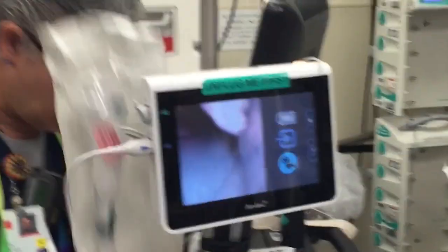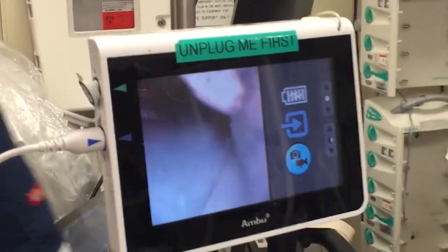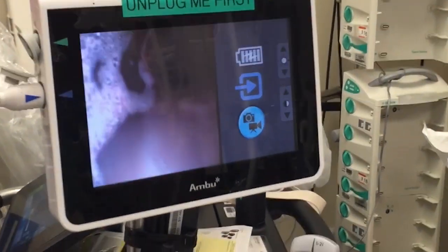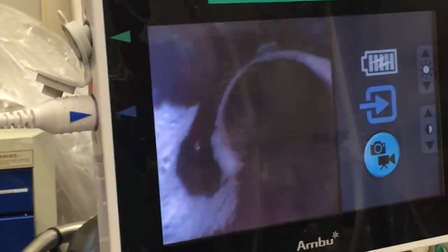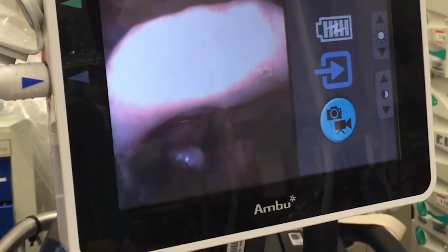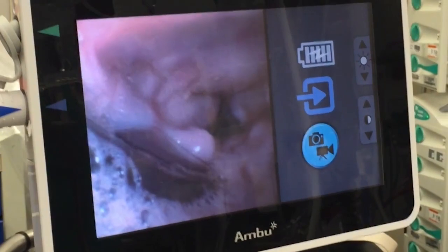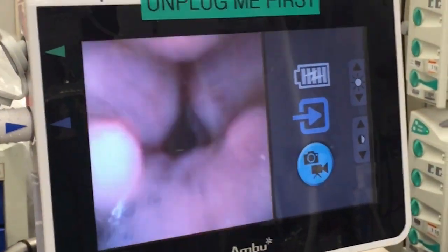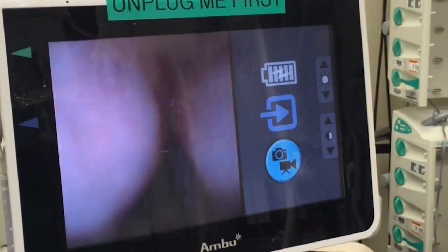Now you're seeing the scope coming out the end of the barrel of the LMA. There you go — you can see the cords right ahead of you. Now take your time. He's paralyzed and being ventilated. Just drive carefully. Come over the top.